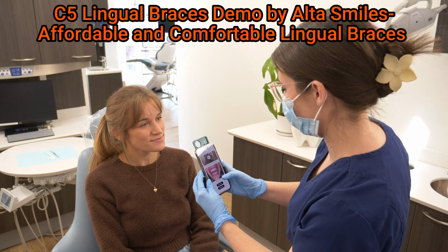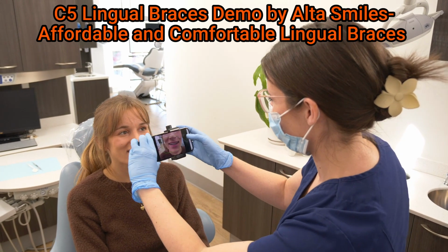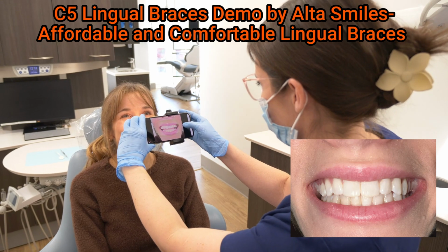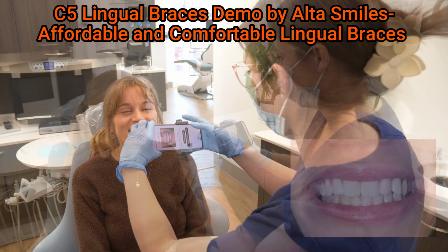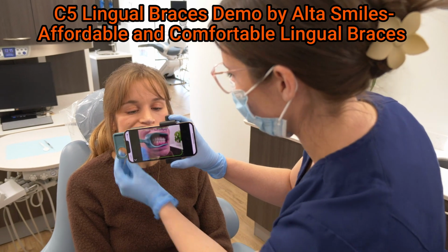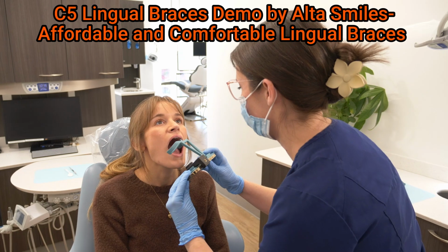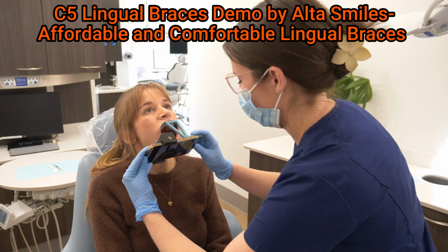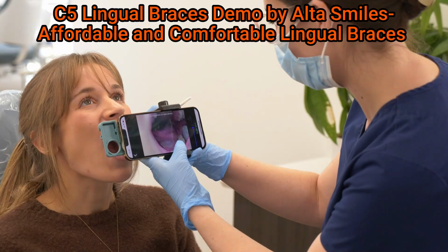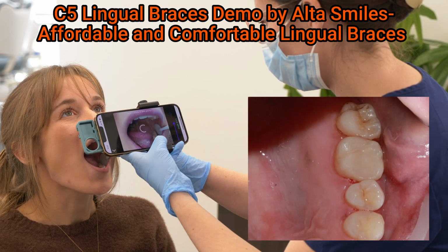Intraoral images. Users can take up to six predefined intraoral images. Center open and center closed images can be taken without the need for any attachments. V5X cheek retractors assist in capturing buccal images. V5X lip retractors are used for upper and lower occlusal views. Custom images can be used to focus on specific areas of concern.